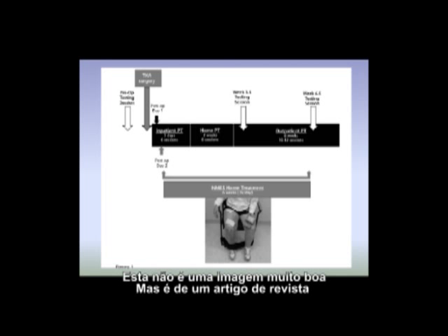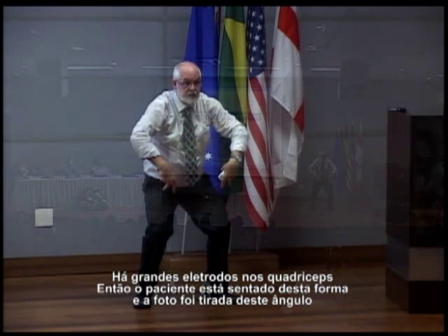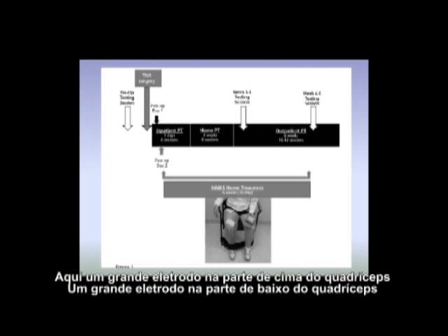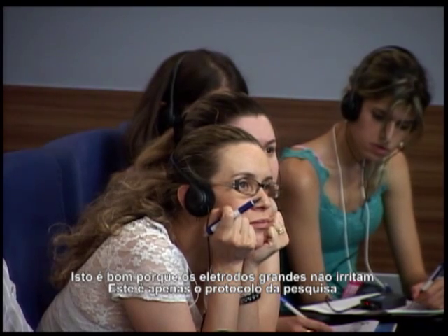You can just see, sorry, it's not a good picture, but this is from the journal article. You have big electrodes on the quadriceps. So this is the patient. I'm not a lady, but that's a lady. Okay, so she's sitting there, and you'll look at your picture is taken this way round. So that's a big electrode at the top of the quadriceps, big electrode at the bottom of the quadriceps. That's kind, because big electrodes are not irritating, right? And that's just the research protocol.